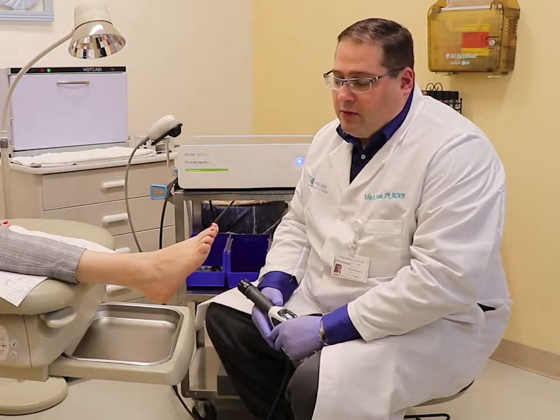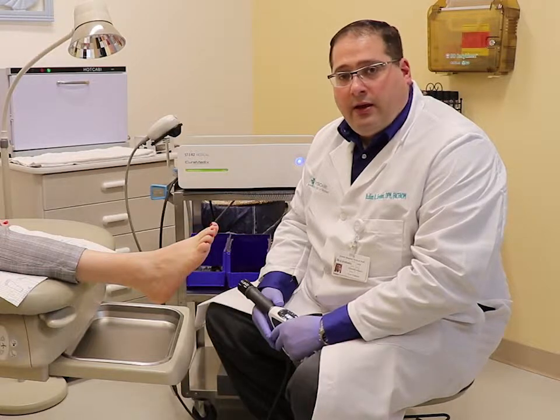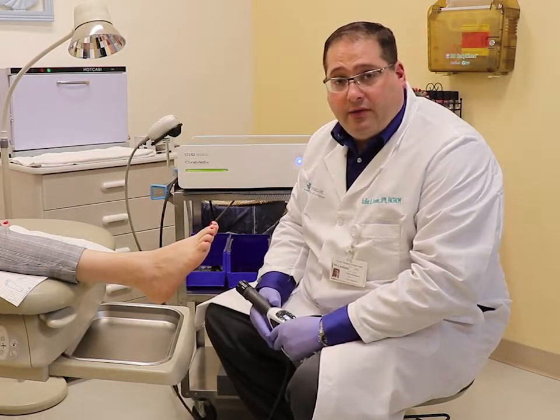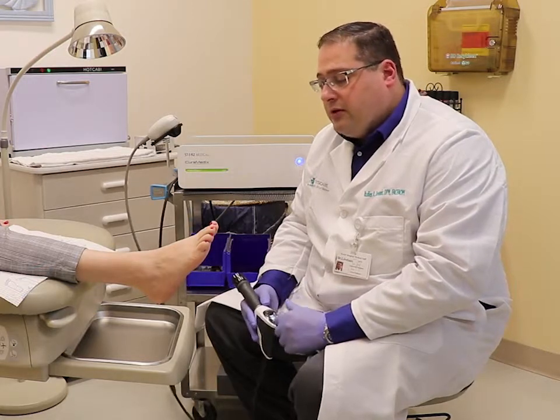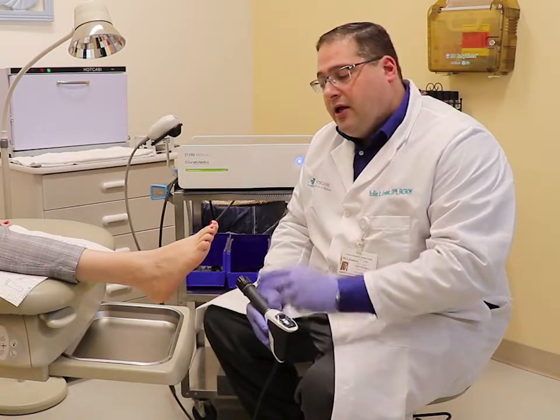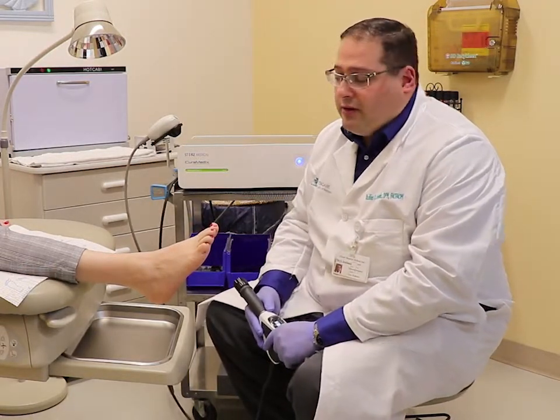Typically, a response is noted after week two when the person presents for the third treatment, where a large decrease in pain is reported. On average, the success rate of this treatment is about 90%. Personally, I've been doing this for three years and my success rate is around there. And through the literature, the research has shown about a 90% success rate of this.